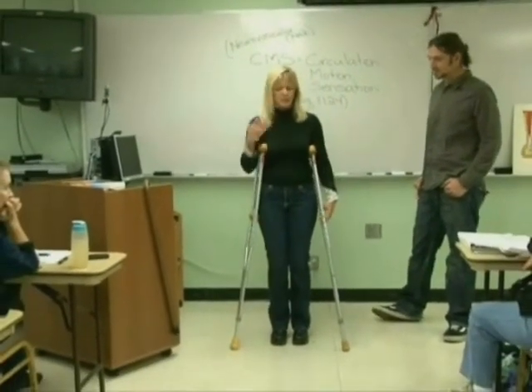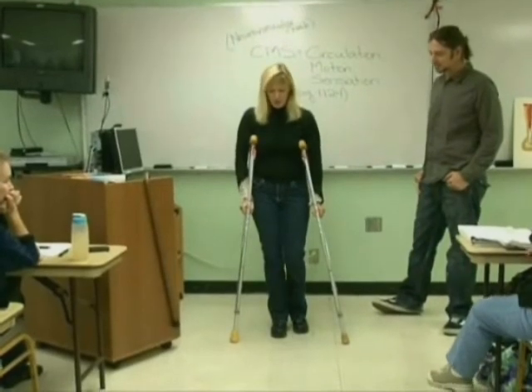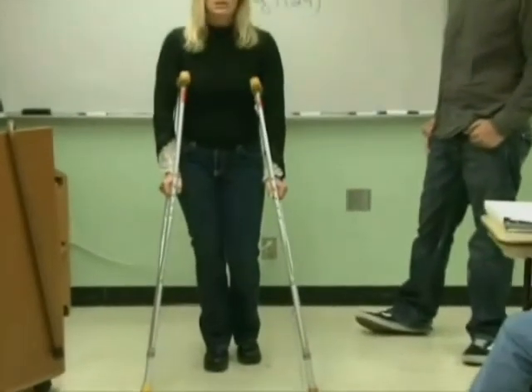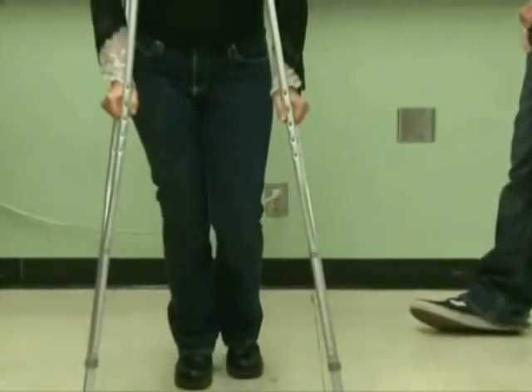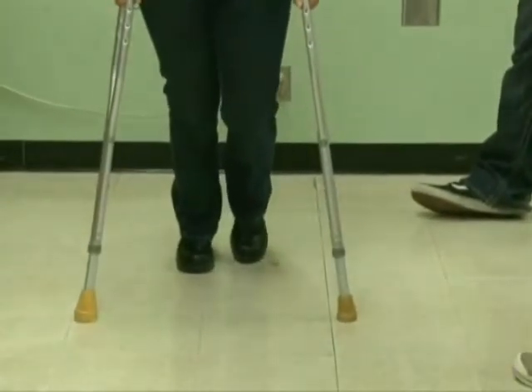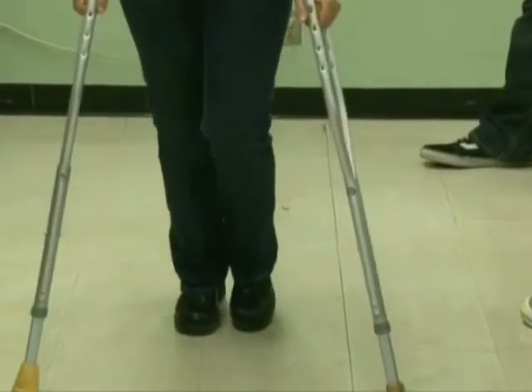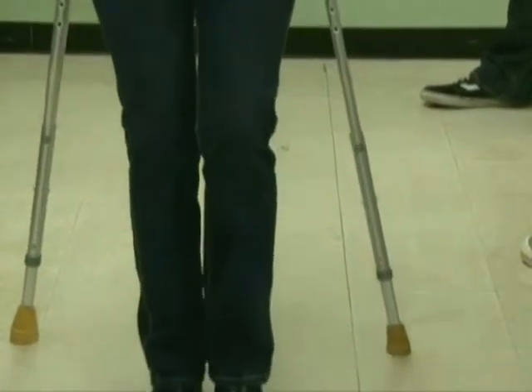The swing-through gait is just like a swing — when you swing somebody on a swing set. What you do is put your crutches forward a little bit farther than you did with the three-point gait, and you swing both legs at the same time through and to the other side. Do not put weight on your left leg because of your knee.